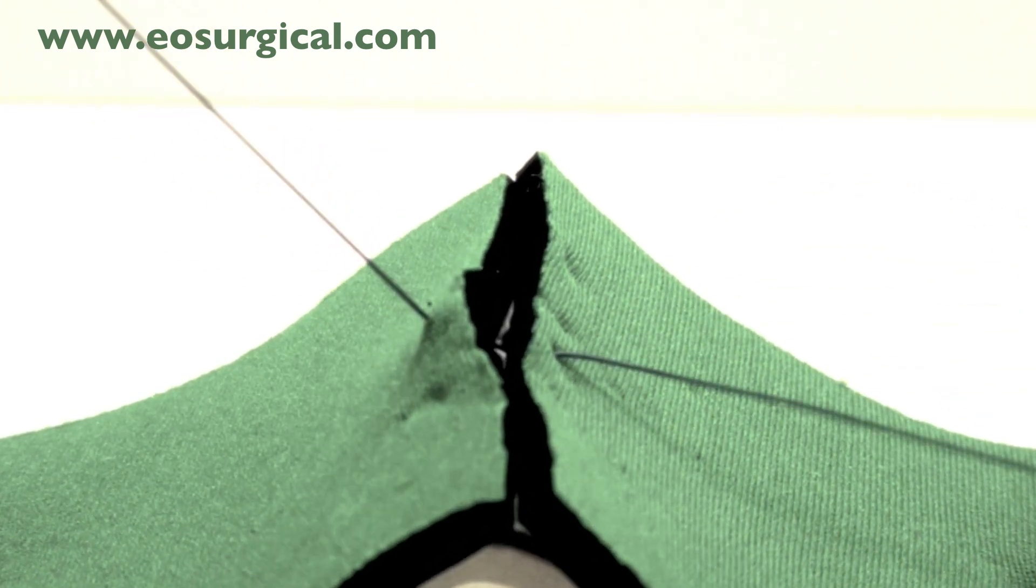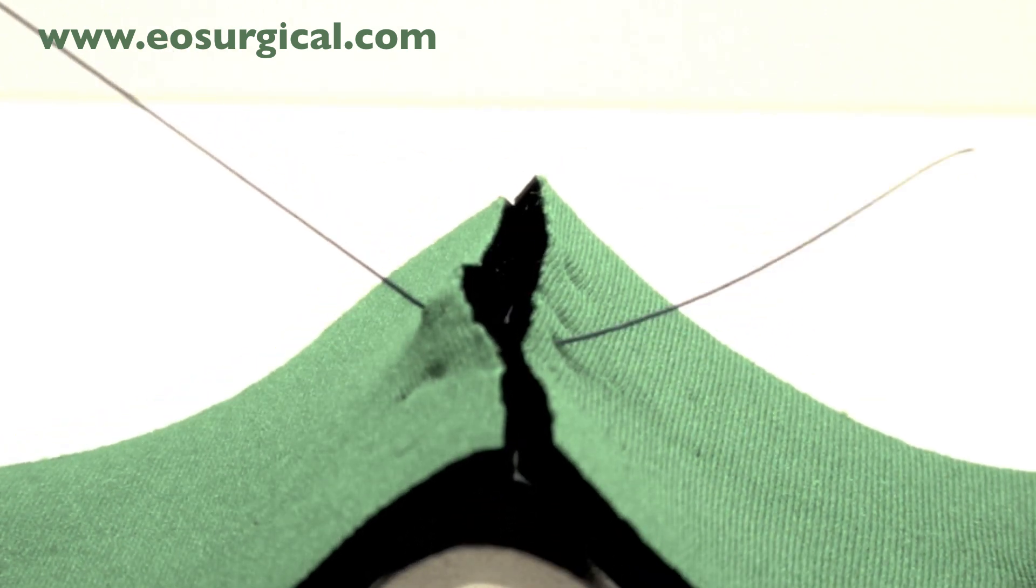Make sure you pull through your suture so that only a small amount is left at the end. This makes suturing a lot easier.